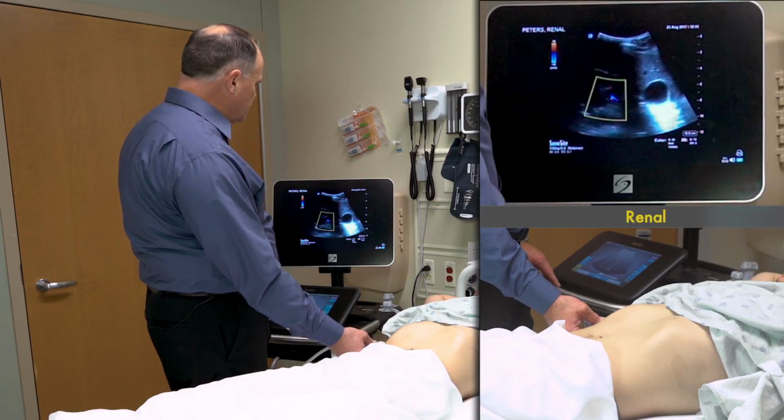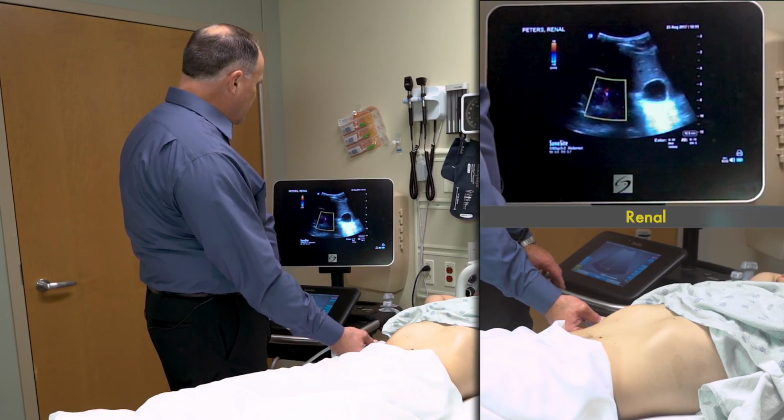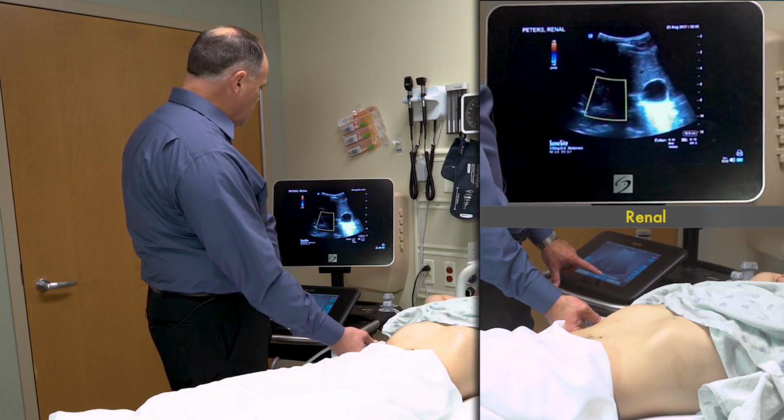So if I see a dilated tube with fluid, I always verify whether or not that's the collecting system or the vasculature of the kidney by turning on color Doppler.